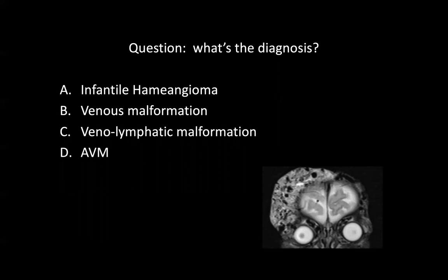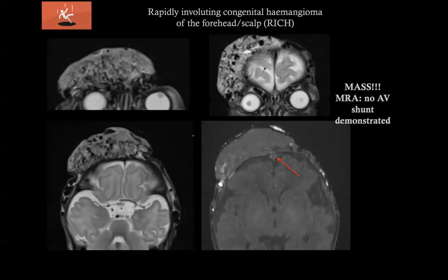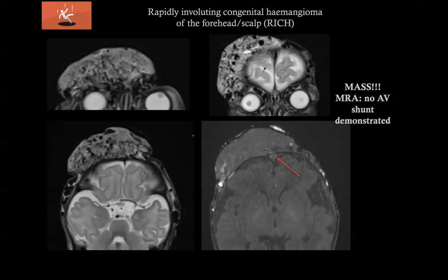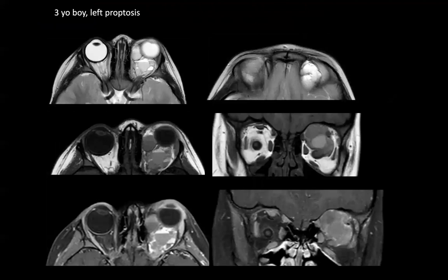30 seconds past. This came with a diagnosis of infantile hemangioma, but it is actually not an infantile hemangioma — it was a congenital hemangioma of the forehead and skull. They look exactly the same; it is just clinically different. The main point I want to make is that there is a mass. If there is a mass, no matter how many vessels are present, this cannot be an AVM. Look — with all these vessels and a large vein, there is no shunt, particularly here at the anterior sagittal sinus. The MRA does not demonstrate shunt. Mass present, lots of vessels — this is a hemangioma.